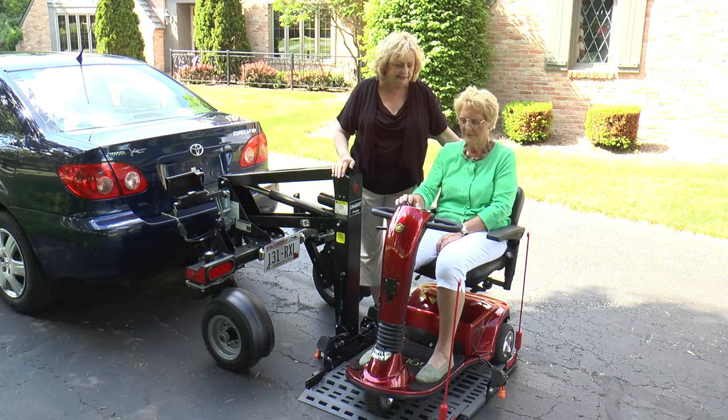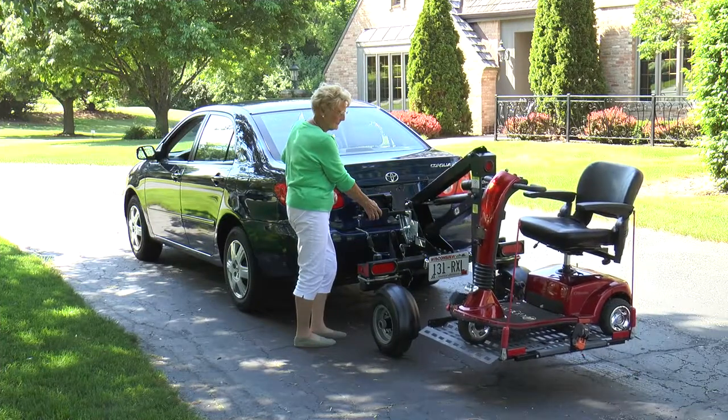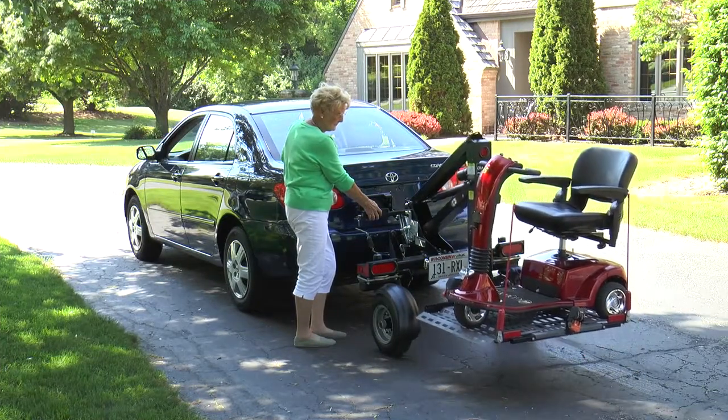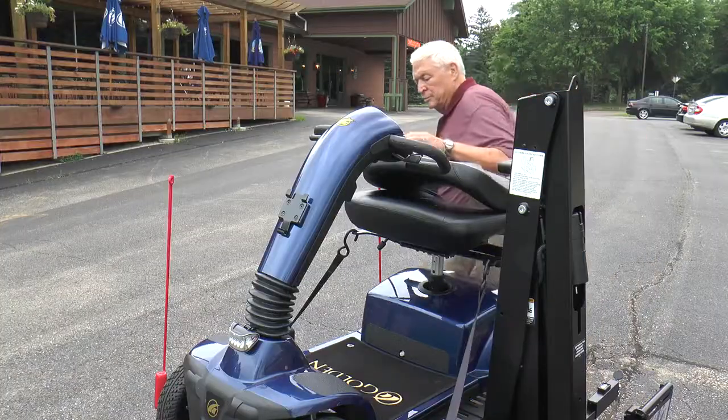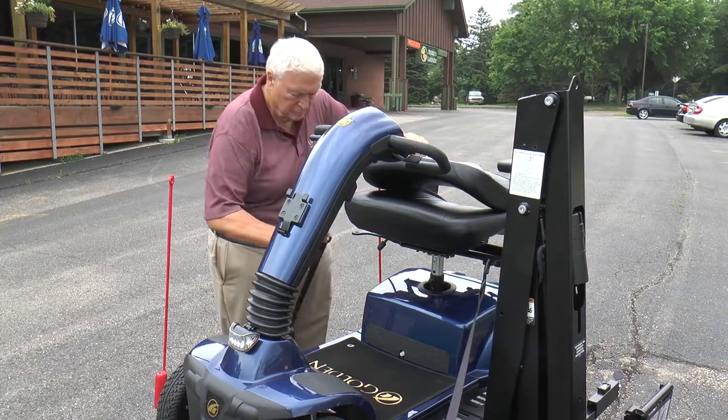Using a mobility device helps keep your independence. Bruno wants you to have just as much freedom in transporting your scooter or power chair. For the first time, mobility devices weighing up to 350 pounds can be transported with mini sedans, thanks to Bruno's patented Chariot.